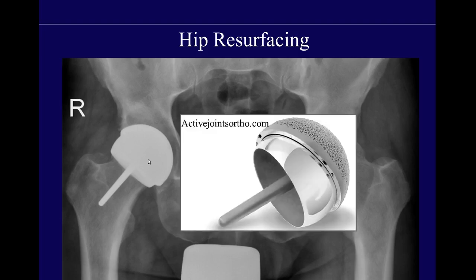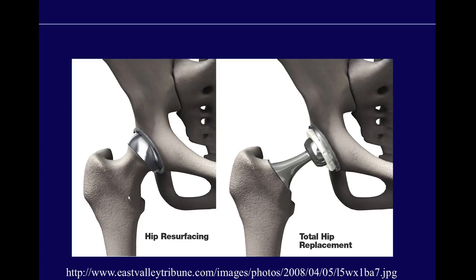In a non-clinical picture, you can see it's a metal head articulating with a metal cup. There's a single peg — the surgeon whittles the head down to size, the cup is fixed into the acetabulum, and it's press-fit over the reshaped head. Cement is placed underneath as a grout to distribute forces. It preserves all femoral neck bone stock. In contrast to a total hip replacement, where the femoral neck is removed and the stem goes down into the femoral shaft, hip resurfacing only resurfaces the bearing surfaces.